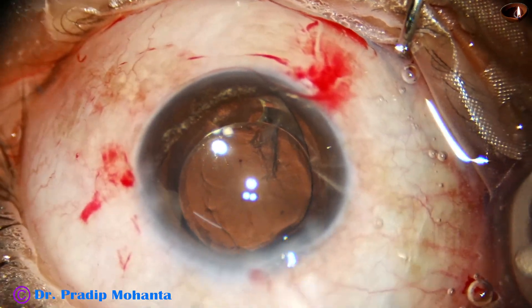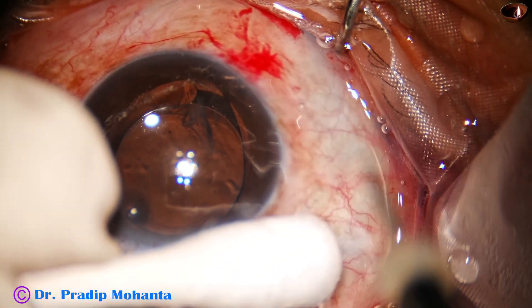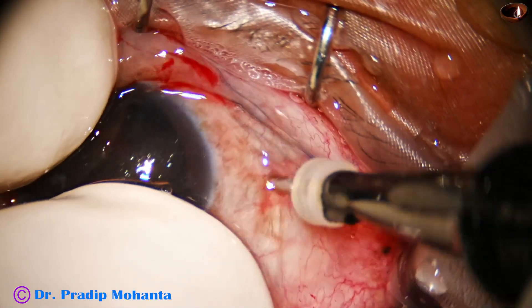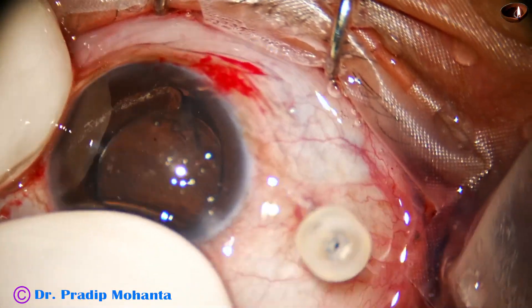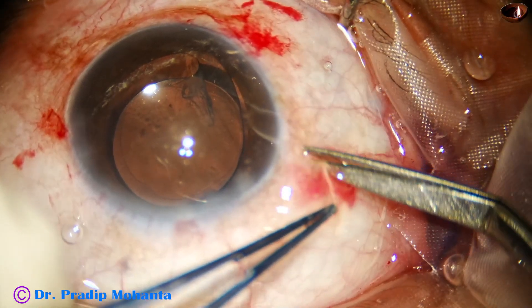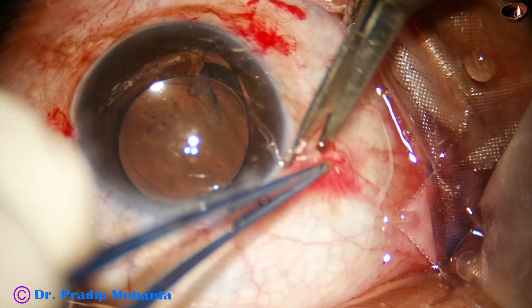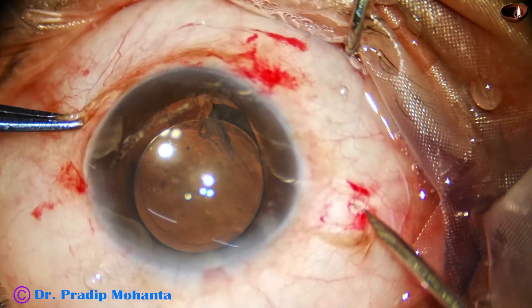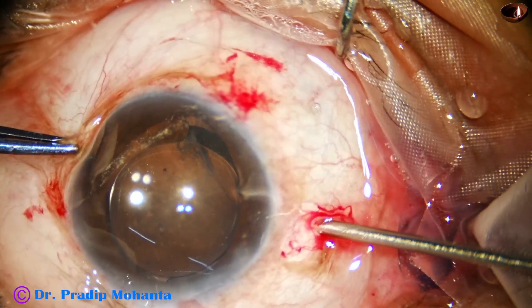The plan is anterior vitrectomy, because there is a big piece of epinucleus in the anterior vitreous. I try to go into the anterior vitreous and place the trocar, but the trocar was not very sharp and it didn't go. So I make a small peritomy and ask for an MVR knife, and through this initial puncture I go into the anterior vitreous.